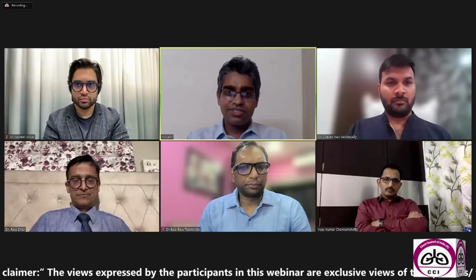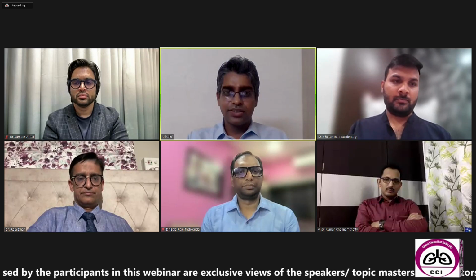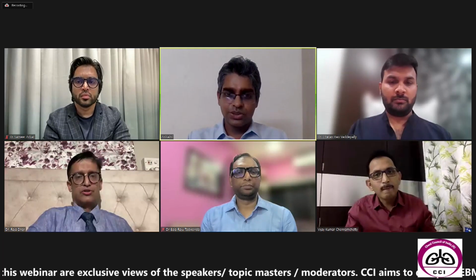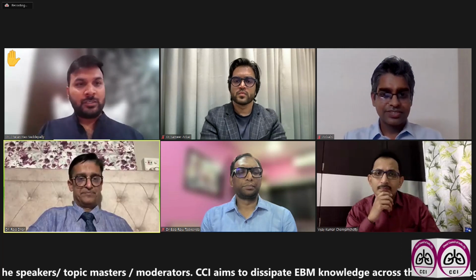Yes, sir. I still feel that by using the TBLB and by using the other radiological reports and our multidisciplinary discussion, we can still arrive at a diagnosis and we can manage the patient well. Sure. Yeah, grand. Thank you, Anirudh. I can see Chetan's hand. So, Chetan, just to continue with your question. When you consider the ILD umbrella, there's one diagnosis which still holds better for TBLB: sarcoidosis.